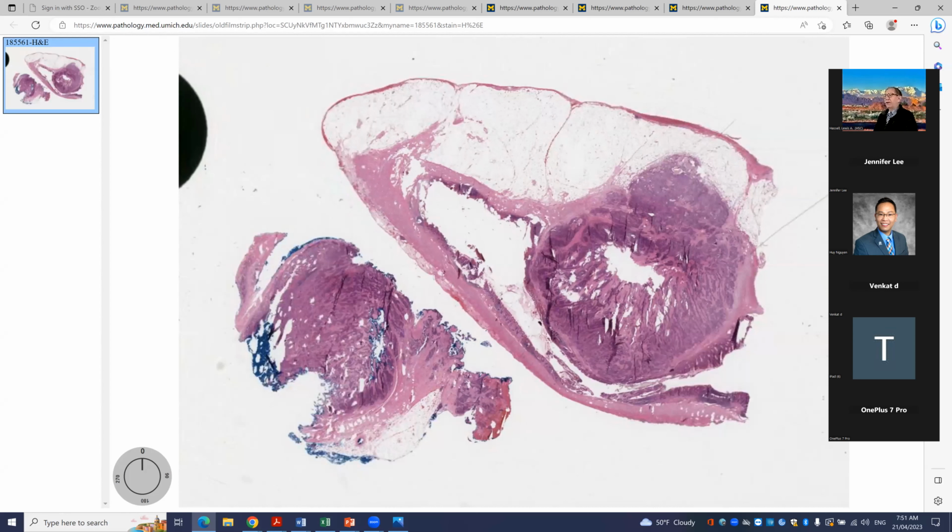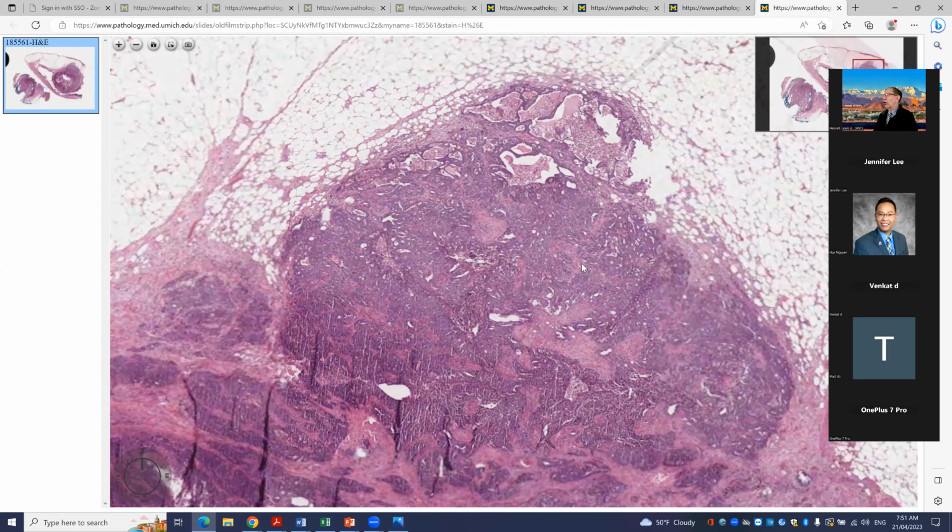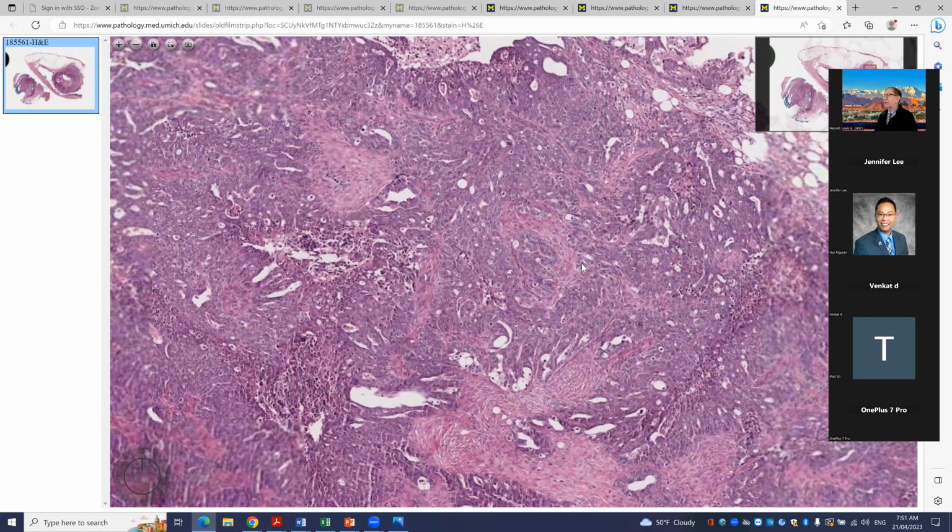And that's just kind of the norm here. And usually when you've got serous carcinoma, this is a disease that is spread by the coelomic spaces. It's not spread through lymphatics or blood vessels in the usual sense.